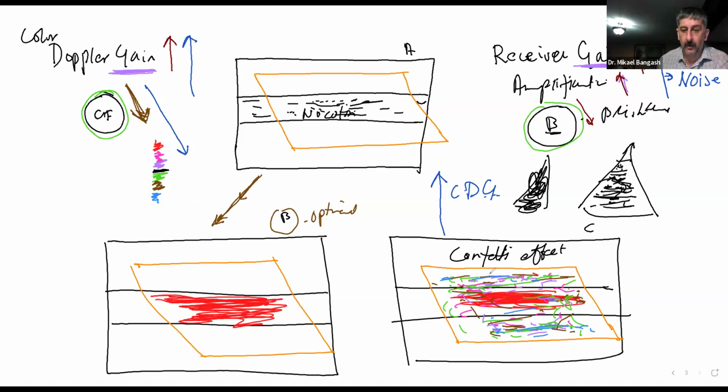it's going to not only fill out the blood vessel, but all the surrounding area, and please keep in mind, still within the limits of the box. It's going to be filled up with not just the color of our blood flow, but any color from your color map. It just splashes into the box and creates what looks like a ton of confetti being released, and that's why they call it the confetti effect.